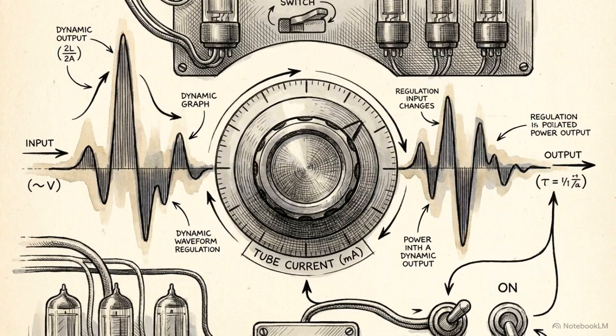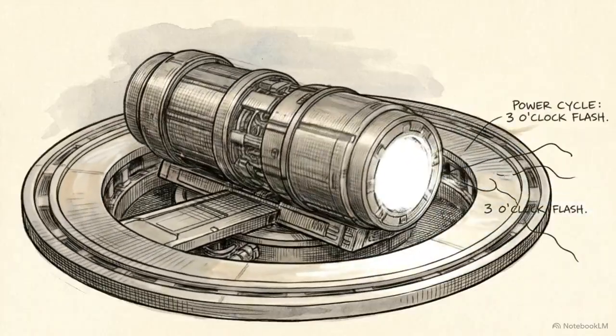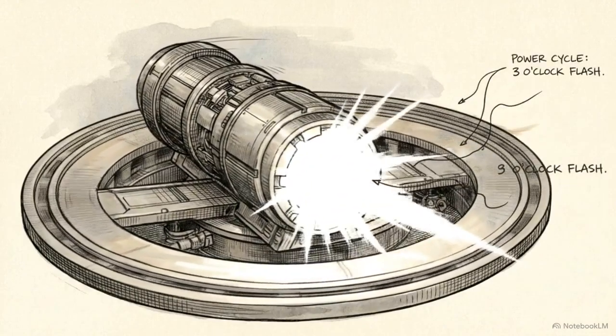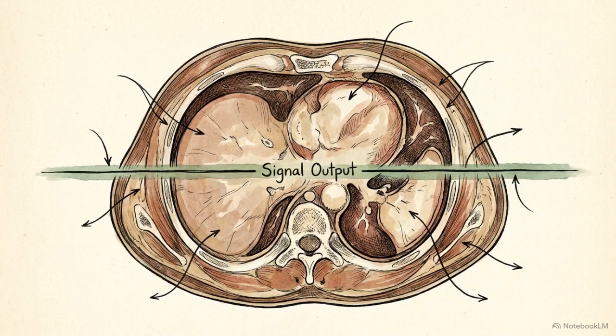A second hardware solution is tube current, or MA, modulation. This system dynamically increases the tube's power specifically during the most attenuating phases of the gantry rotation to maintain signal integrity. This hardware ensures the scanner provides a consistent signal even when the anatomical path varies in thickness.